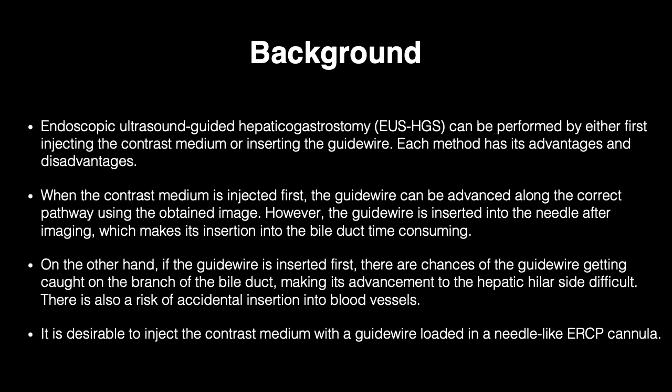When the contrast medium is injected first, the guide wire can be advanced along the correct pathway using the obtained image. However, the guide wire is inserted into the needle after imaging, which makes its insertion into the bile duct time-consuming.